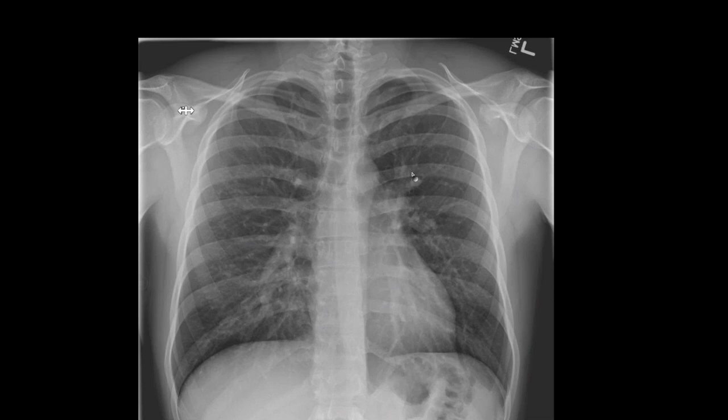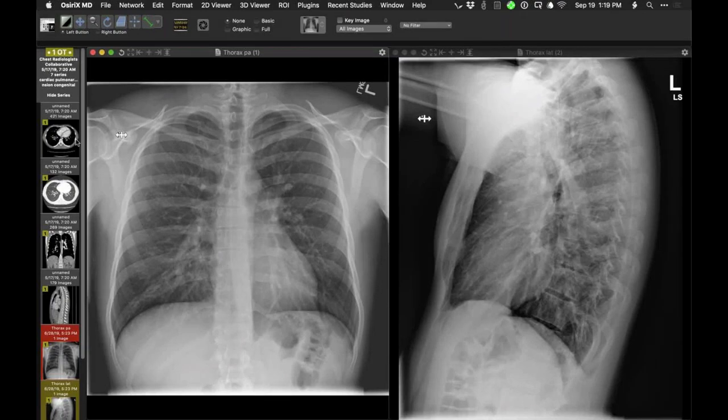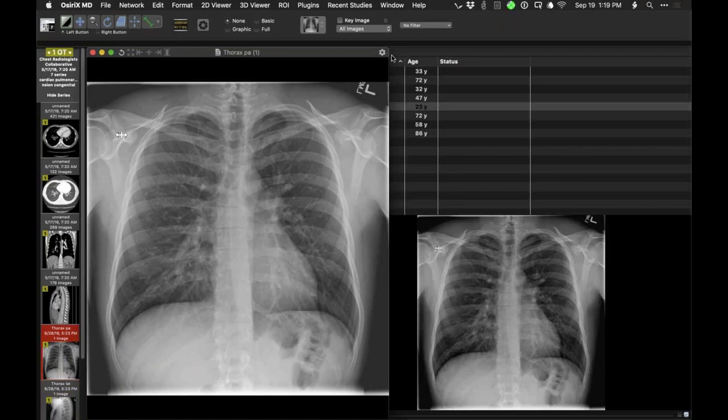And then if you don't have, for example, a distended SVC and azygos vein to suggest that you're looking at a consequence of hypervolemia, then one should think of left to right shunts. So you have increased pulmonary blood flow, and then the question is, is it a real finding? Of course, if it's subtle, you may not be sure, but you might question that and ask, does the person have findings of pulmonary hypertension and anything else to suggest that we do in fact have a left to right shunt? So this is a person that does have a shunt.